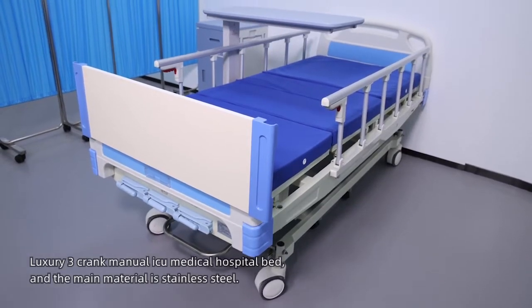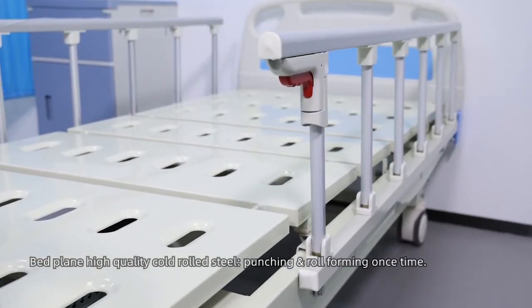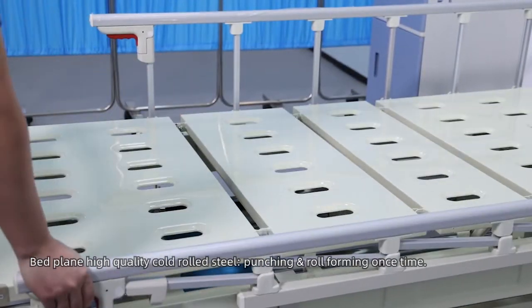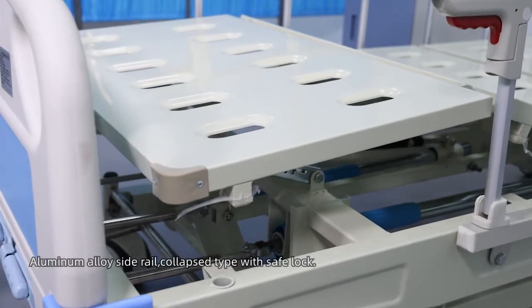Luxury 3 Crank ICU Medical Hospital Bed. The main material is stainless steel. Bed frame is high quality cold-rolled steel, punching and roll forming. ABS head and footboards are removable. Aluminum alloy side rail, collapsed type with safe lock.